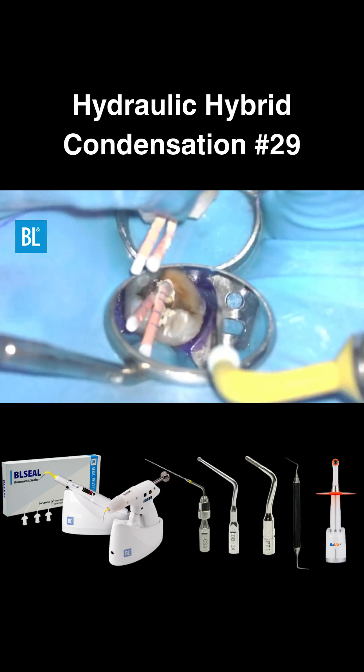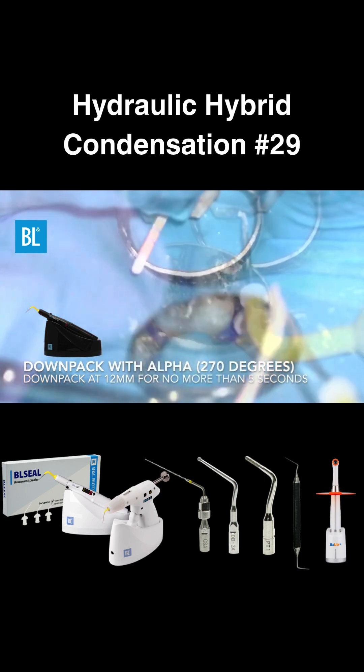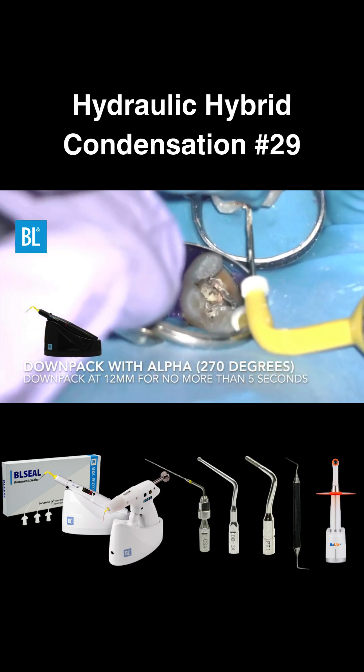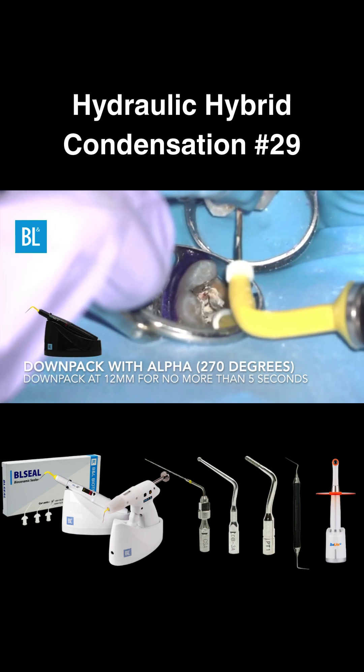After placing the master cone, use the alpha at 270 degrees with a 40-0-4 plugger to downpack to about 12 millimeters. Do not place the plugger in the canal for more than 5 seconds, as it can heat up the PDL space and lead to bone loss.